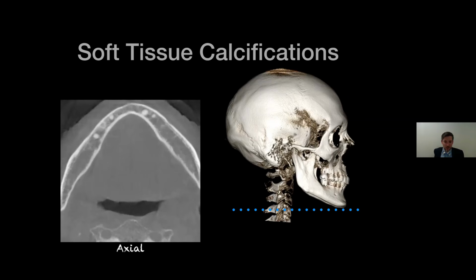I said you could take a quadrant scan or a small field of view scan with ultra low dose, less than a pan, and she was just floored. So the technology is always improving as well.